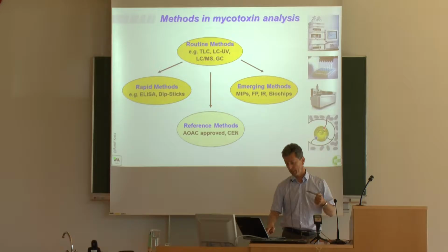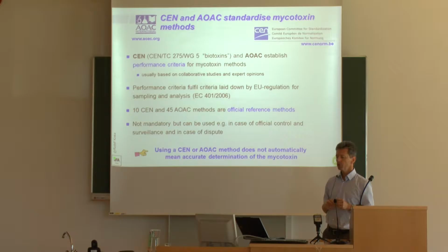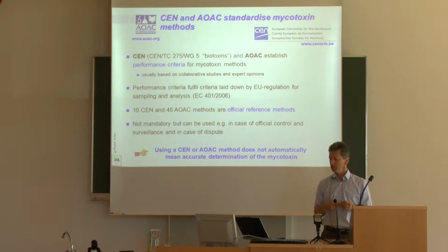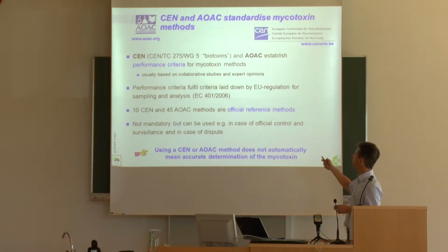Talking about official analytical methods, there are actually CEN and AOAC established methods. CEN being the European Committee for Standardization, they have a working group, number 5, biotoxins. I used to work for CEN myself. Now Michael Sulyok, the head of our multi-toxin group, is now with CEN.